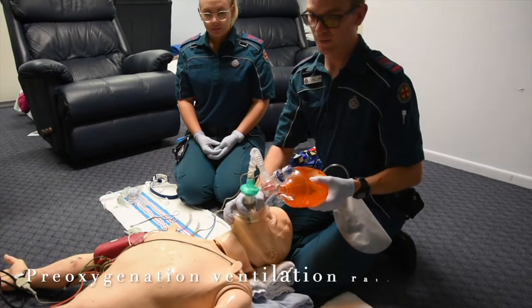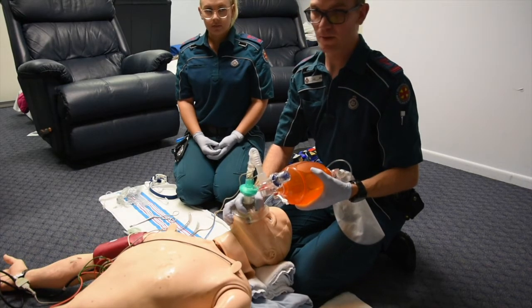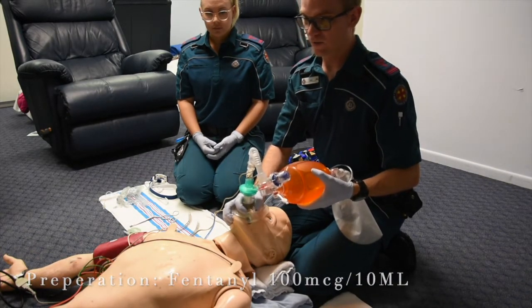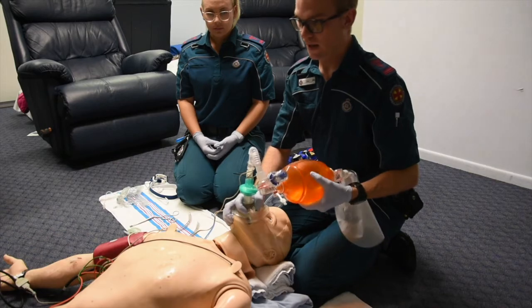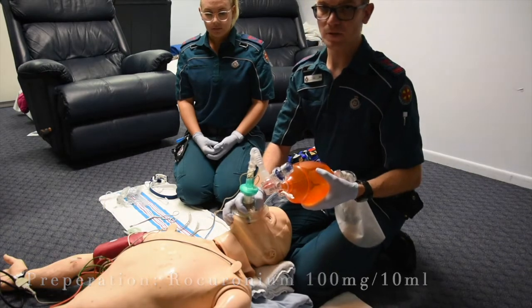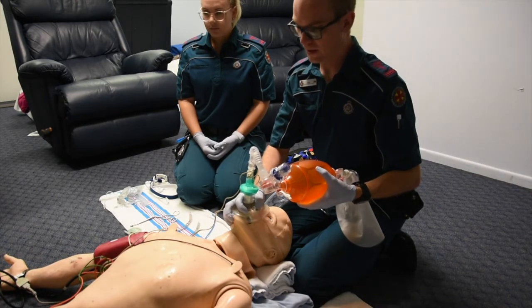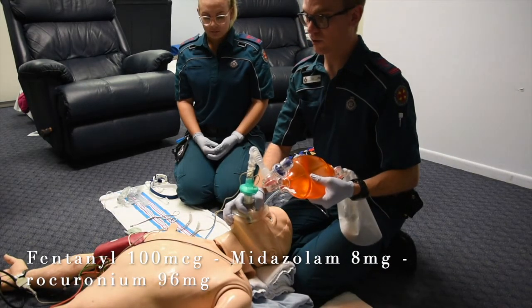So for the drug facilitated intubation, we need to push our drugs. So I've chosen from my induction agents of fentanyl, midazolam, and then my induction paralytic of rocuronium. So 100 micrograms of fentanyl IV, so that's 10 mils, and I'll also be using 8 milligrams of midazolam, so that's 8 mils. And I'll also be using 96 milligrams of rocuronium, which is 9.6 mils. So I've mixed that in 100 milligrams and 10 mils. The reason I've done this is I'm assuming he's an 80 kilo male. So I'll get my drug assistant to push those, fentanyl first, then midazolam, and then rocuronium.